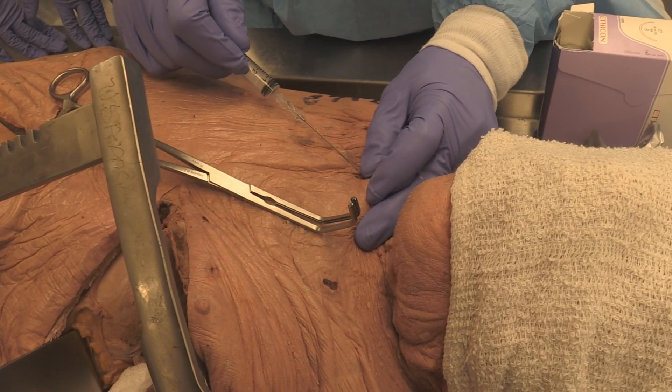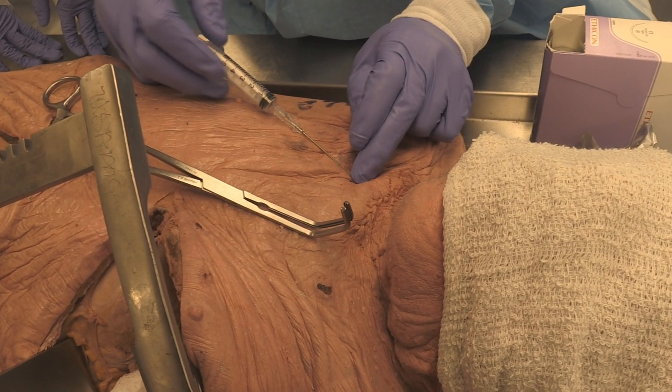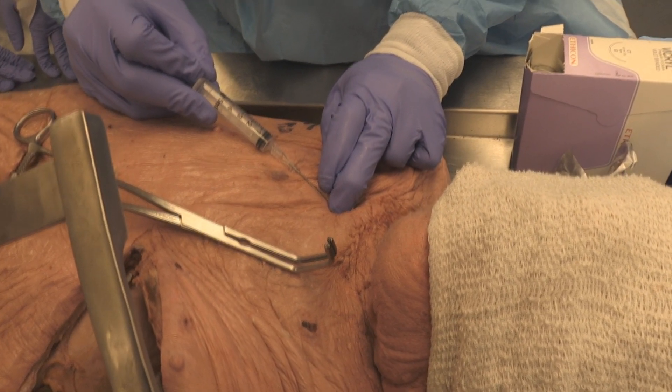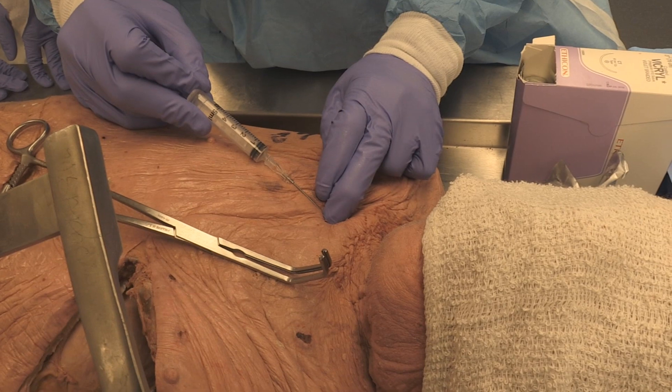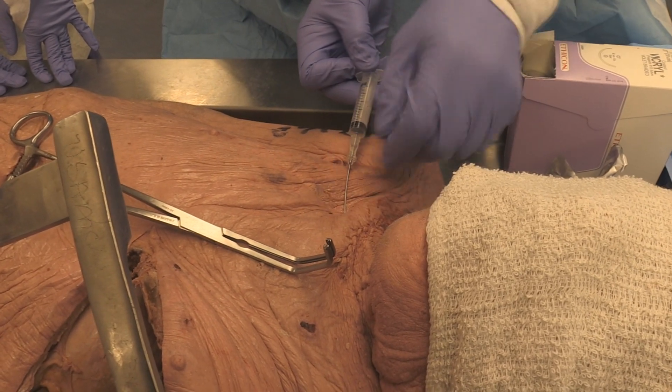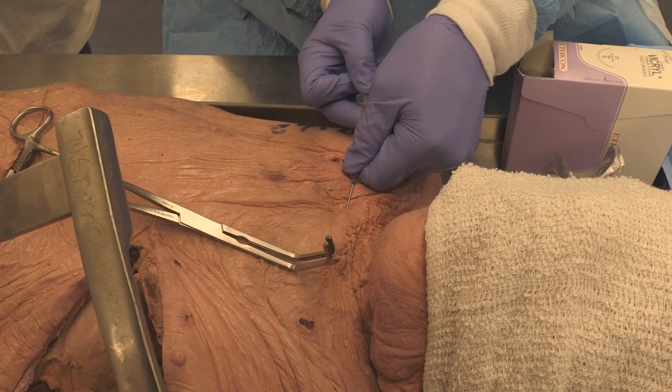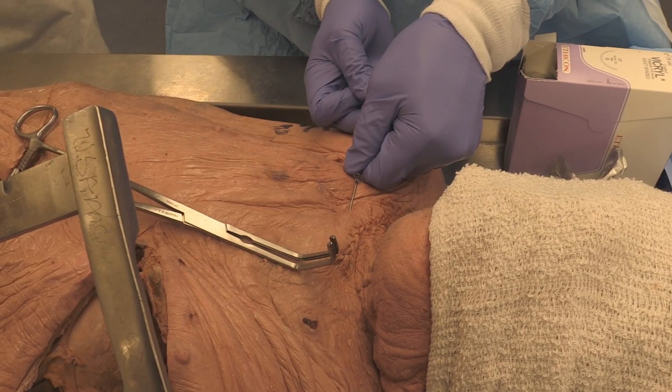Put the needle into the clavicle as far as I can to the clavicle. Push the clavicle down with my index finger. Push the needle down up under the clavicle like that. I'll stop right here. As soon as I got it up under — turn, push, boom — I'm in. And I'm aspirating at the same time. I turned the bevel down. And I'm in at the same time.